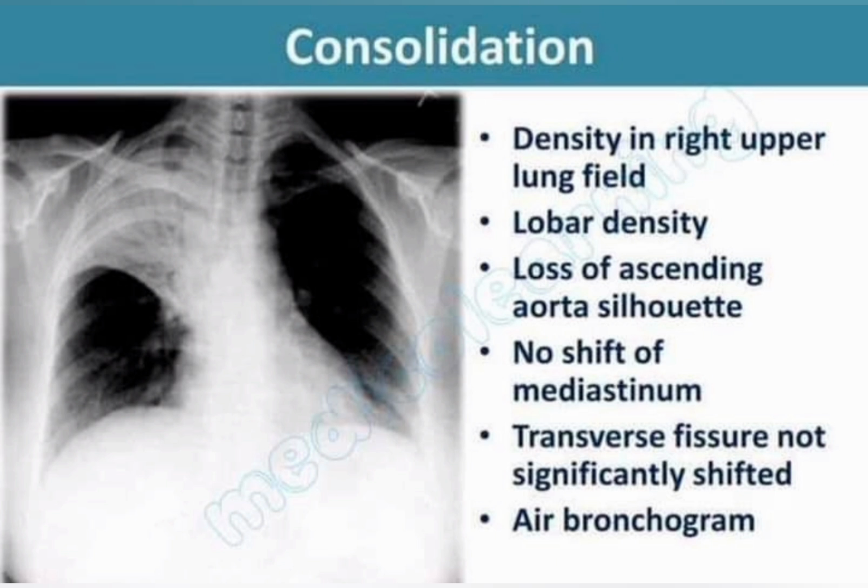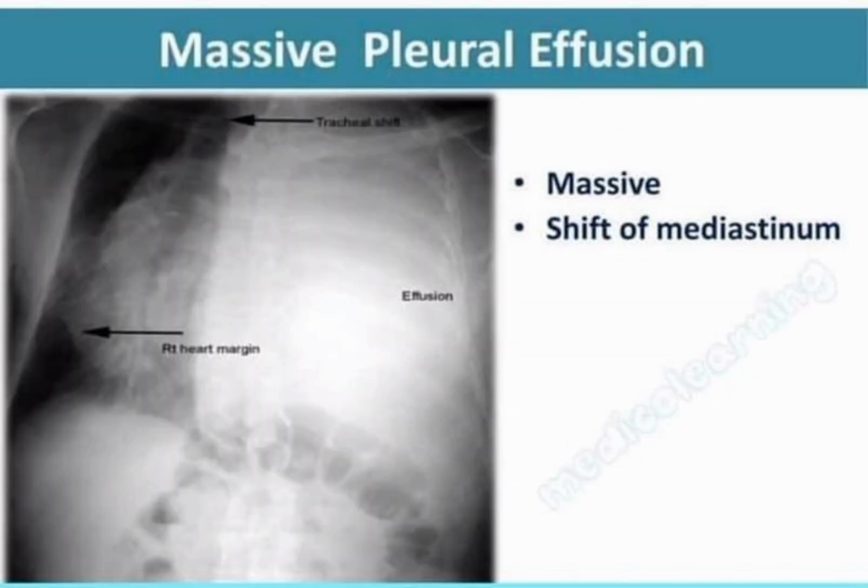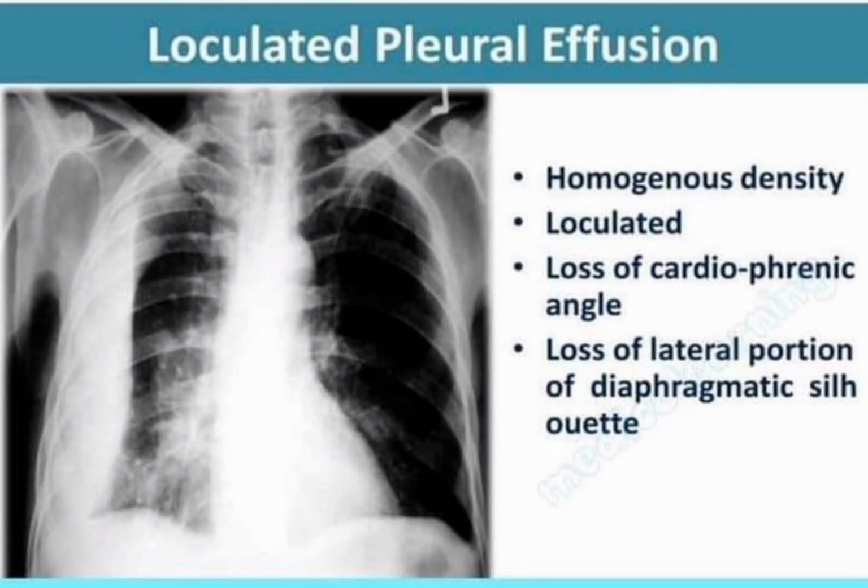Chest X-ray if it is suspected that you have any of the following: enlarged heart, which can mean you have a congenital heart defect or cardiomyopathy. Fluid in the space between your lungs and your chest wall, pleural effusion. Pneumonia or another lung problem. Ballooning of the aorta or another great blood vessel, aneurysm.